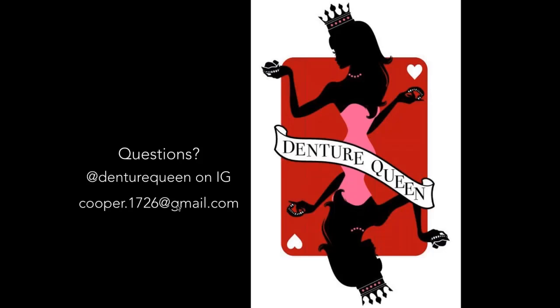The next question is, do you use the study model mode or the impression tray mode in the Trios to scan the dentures? What I do is I make my records and then I use the study model mode and start scanning the entire tissue surface first, and then I start wrapping the scan over the borders along the edges in order to capture the labial surfaces of the teeth. I do have a video on Avident's website and also on Facebook that goes over this. You want to get the tissue surface as well as the lateral sides of the teeth of both maxillary and mandibular records, and then you use the Trios to align the bite and wait for the Trios to do the alignment. That way you'll end up with your maxillary and mandibular records, tissue surfaces, and the teeth, and they will be in alignment according to the Trios.